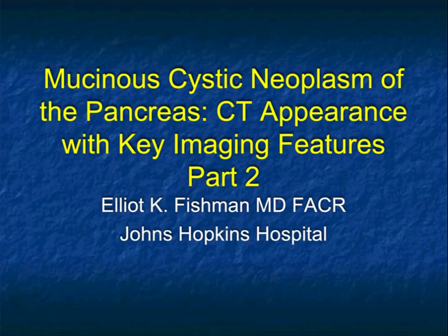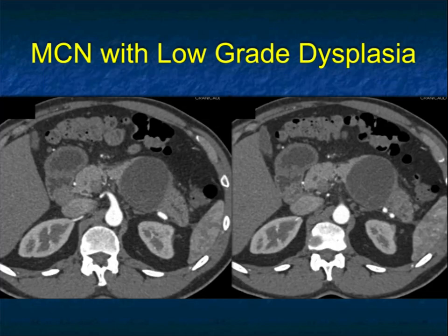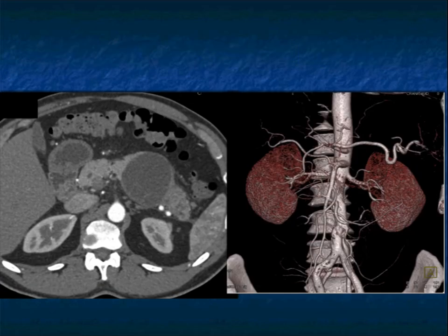Hi, this is Elliot Fishman, and welcome back to part two of our talk on mucinous cystic neoplasms. In part two I'm going to show you another set of cases. I left off with this case before. This case might be a touch unusual — you vaguely see the pancreatic duct. Differential: 45-year-old female, location, appearance. This was an MCN — not very tricky.